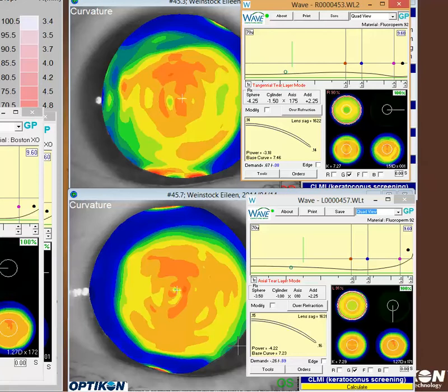In your case, you can actually see that a little bit — not so much in the right eye, because that lower right hand corner picture isn't too much different than your actual topography. However, if you look at the left lens, you'll see almost a little corneal astigmatism, but if you look at that lower right hand corner picture, it almost looks like a spherical cornea. Sometimes that will cause the lenses to be a little misrepresented in design and contribute to some difficulty with the fitting.